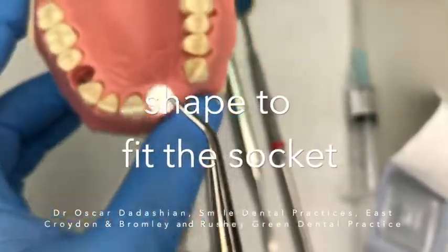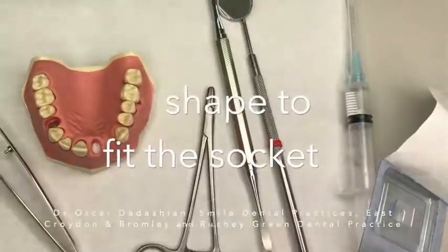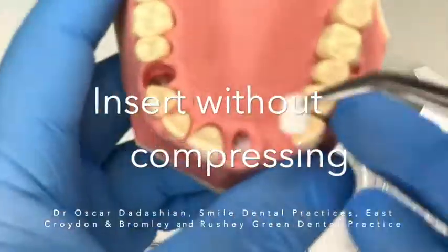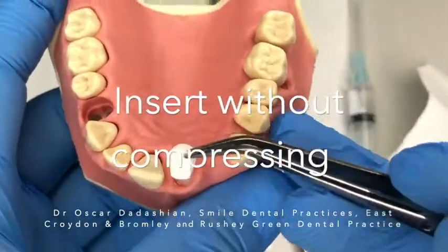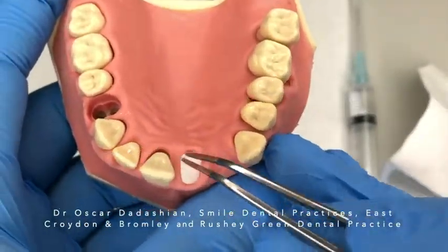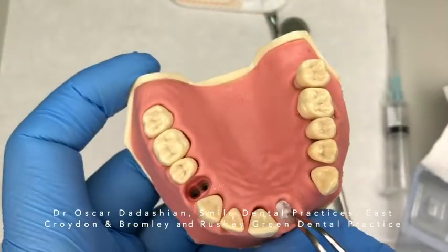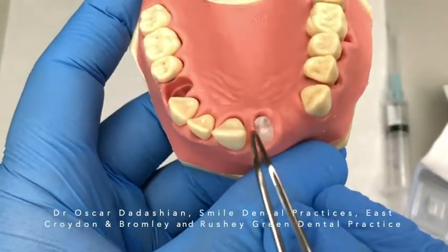Now I'm going to shape it to fit the socket and then just insert it into the socket gently, without compressing it. This material will soak up the blood from the socket, so it's important that there is some blood in the socket before you insert this.